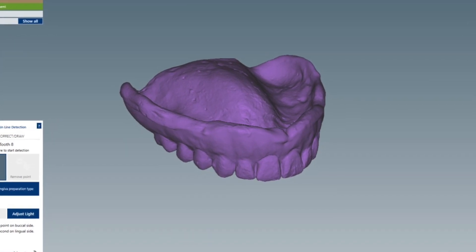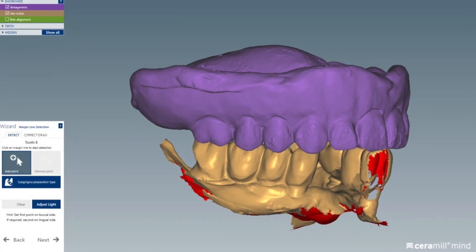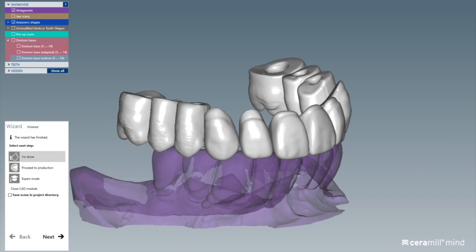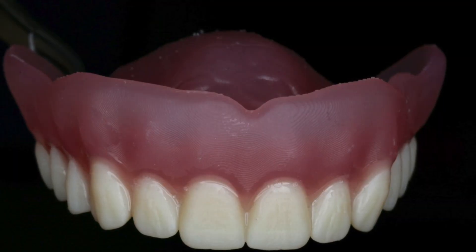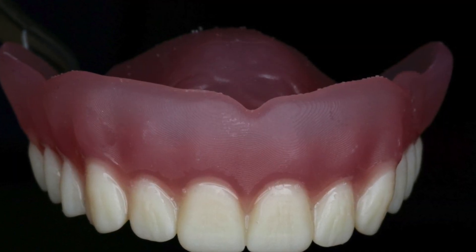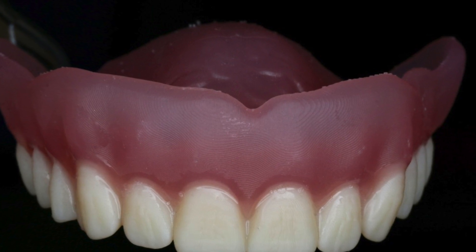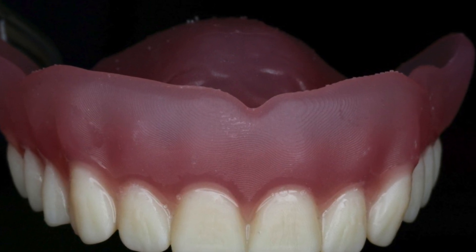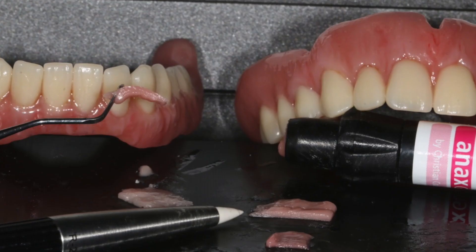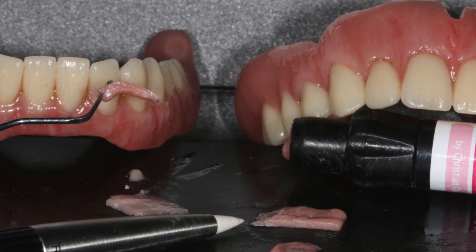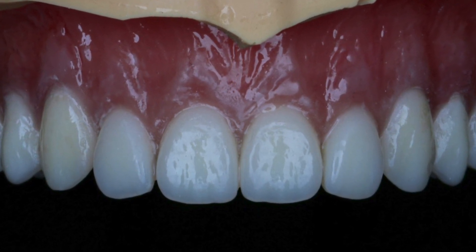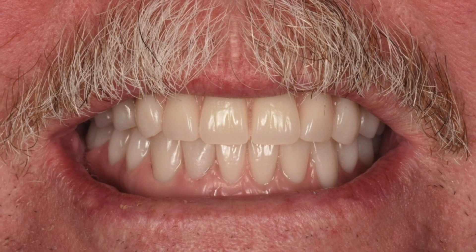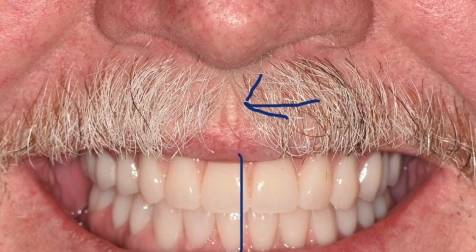Most technicians and clinicians are not used to working up a digital denture completely virtually — they are used to setting teeth in wax and being able to move and adjust them instantly. With digital dentures, we plan the setup virtually and can print a prototype. This prototype allows a physical try-in before finishing. It can be in tooth-colored resin, or we can add pink composite or acrylic so the patient better understands the pink-white aesthetic.